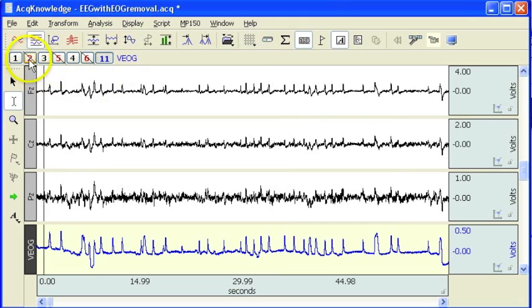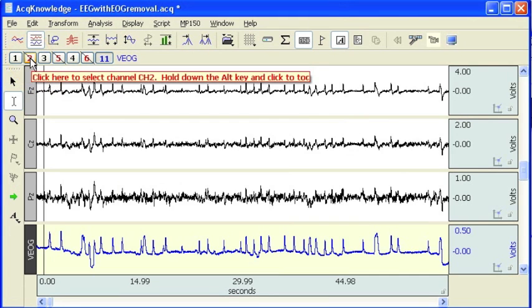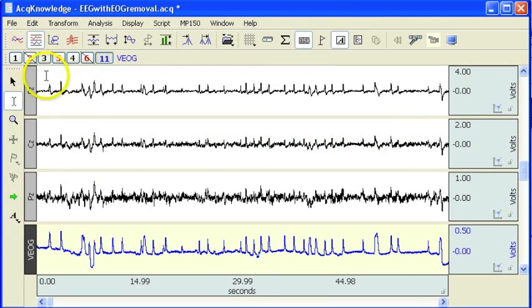You can see I've got some channels hidden here. I've already duplicated FZ, CZ and PZ so that we can get a look at the before and after. In these particular channels, you can see there's a fair amount of EOG artifact. This can be quite typical if a subject is watching a presentation or a movie, staring at a screen; you quite often get some pretty pronounced blinks.